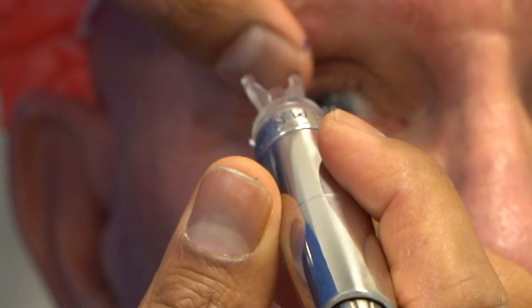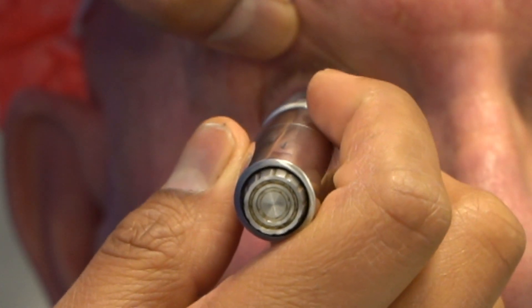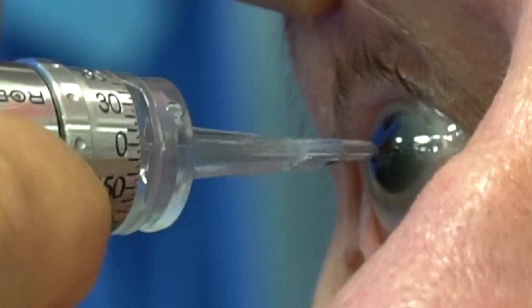Just showing that again — as I move in, little finger, thumb, eye looking straight ahead. This patient is fantastic, looking exactly straight as he's told. A lot of patients have difficulty with that, so he's doing really well to be able to look forward.